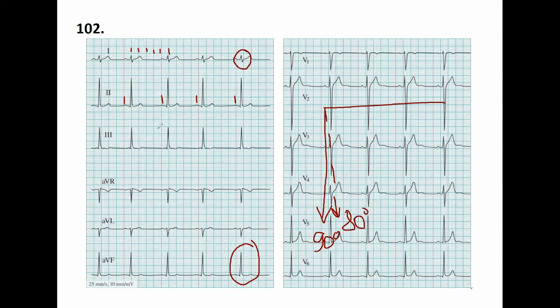Okay. Now, very similarly, let's look at lead number 2 and lead number 3. Okay, lead number 2 is located, I'm changing the color, located at 60. And another one, lead number 3 is 120. Okay, 120, and this is 60. Good.